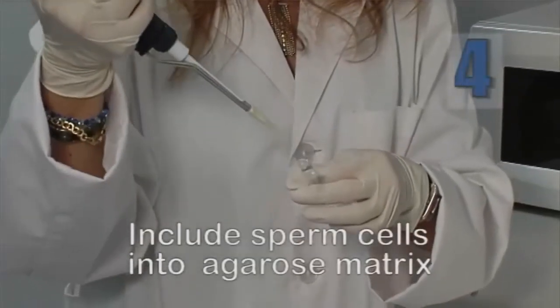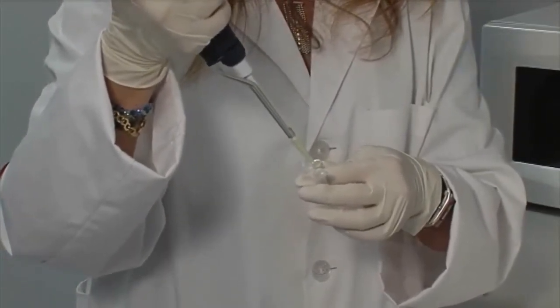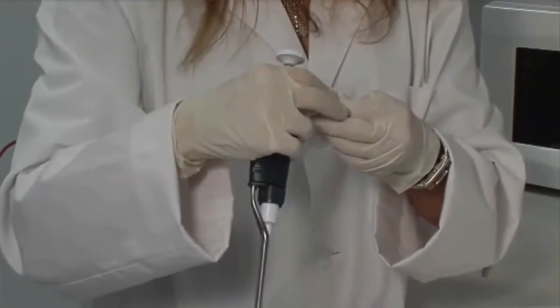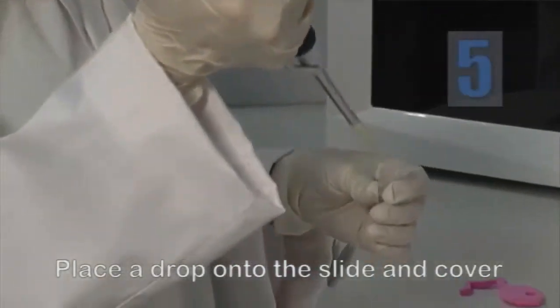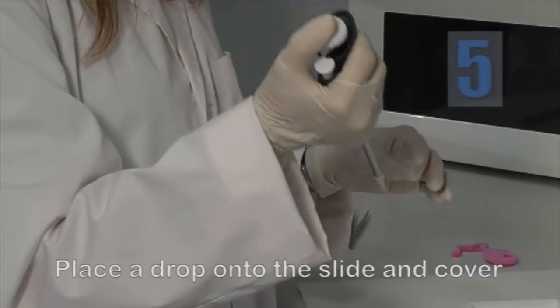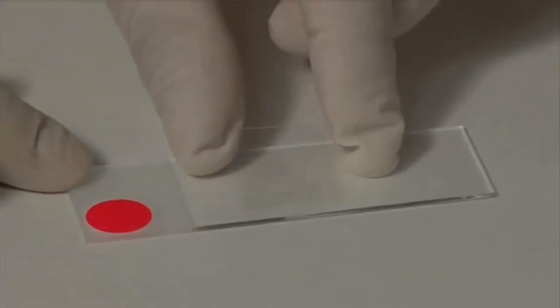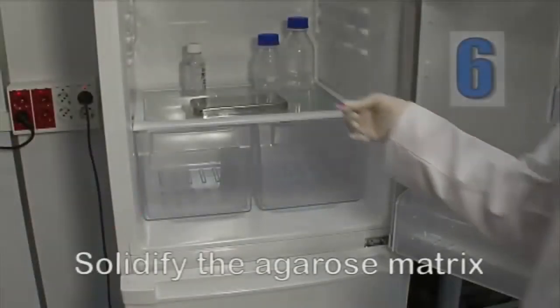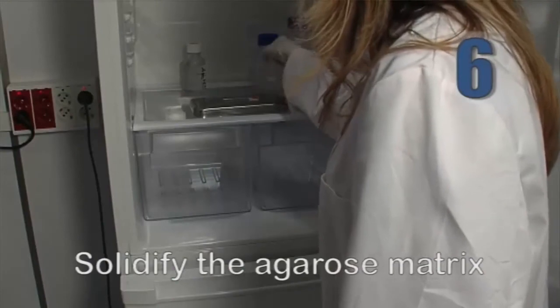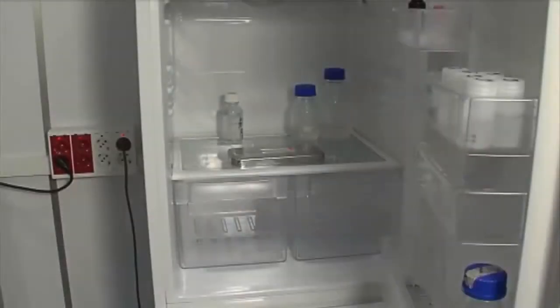Add 25 microliters of diluted semen to the liquefied agarose and homogenize. Place a 15 microliter drop of the mixture onto the pre-treated side of the slide and cover with a cover slip. Make sure to avoid the presence of air bubbles. Place the slide on a cold surface such as a metal plate and introduce it in the fridge at 4 degrees for 5 minutes so as to solidify the agarose gel.